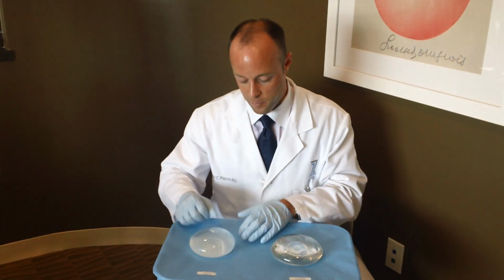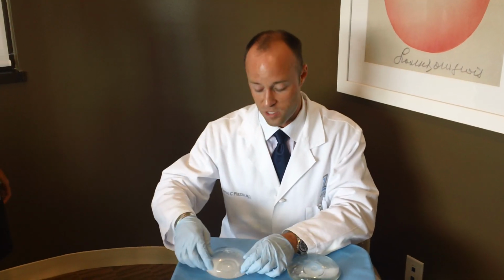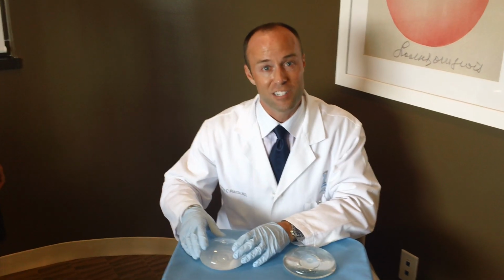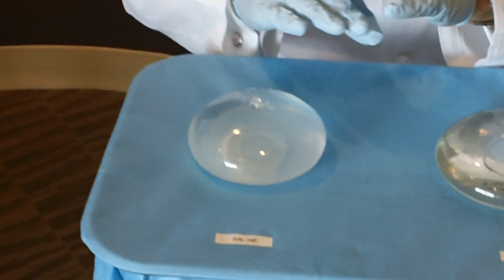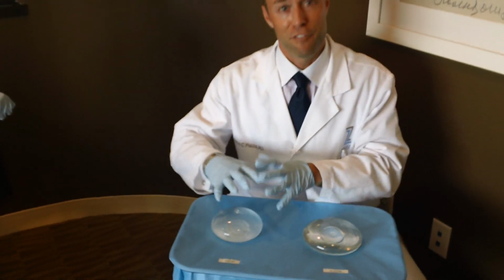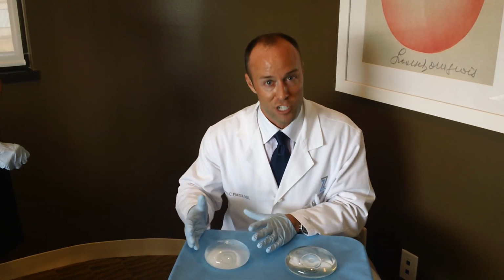When we look at the saline implant, actually this is a great device that's been around for quite some time. The outer shell is actually a silicone elastomer. So it has a silicone outer shell, but the volume inside is actually saline fluid. This has a little valve, and these come flat to us in the operating room, and we actually place these inside the patient, usually through a smaller incision, and are able to then inflate or add volume to this breast implant in order to get the desired fullness that we want to achieve.